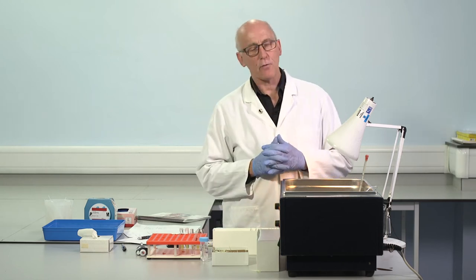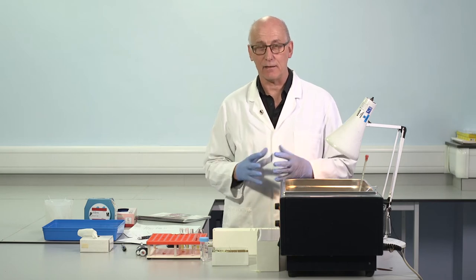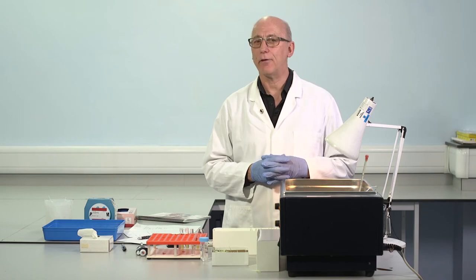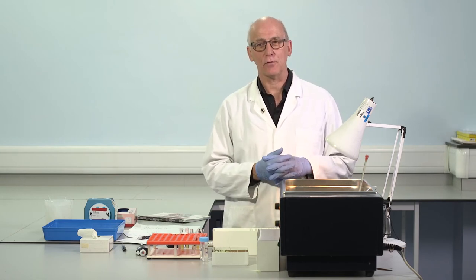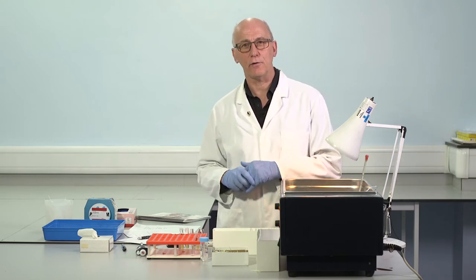So back to reference range. It's really important for APTT to assess this locally. It's important to use healthy normal donors. I think it's not acceptable to use samples from patients who have normal clotting results.